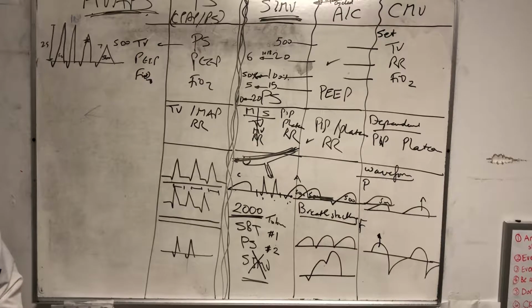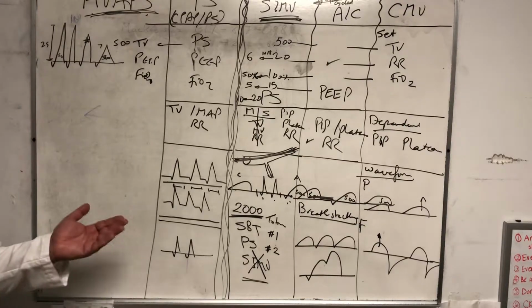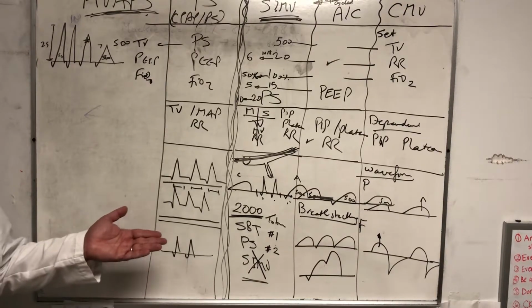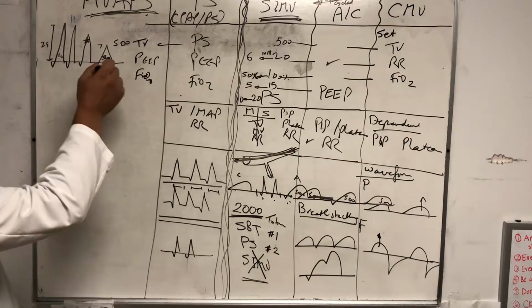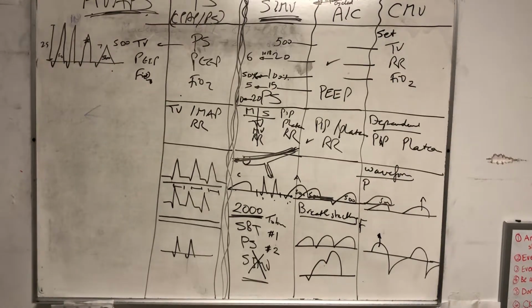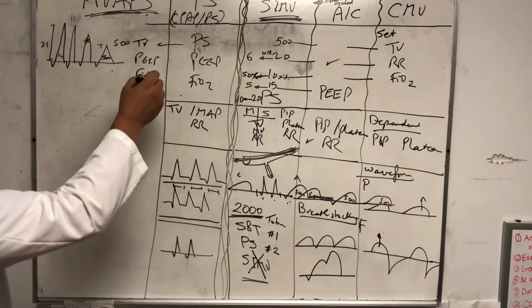If you take over with controlled modes of ventilation, the patient gets weak. So that's why these modes of ventilation are coming on stronger now, because they want to see the patient walking with an endotracheal tube. And you're not going to walk somebody with an endotracheal tube on volume control. That'd be like suicide. You don't want to do it because he's not going to tolerate it. So you give him the simplest mode of ventilation, either this or that, right? Okay.